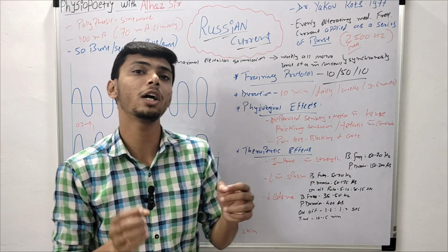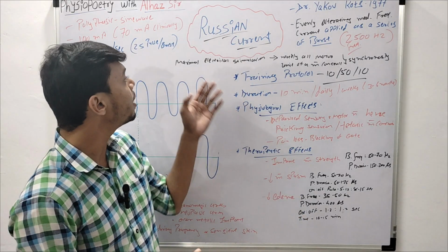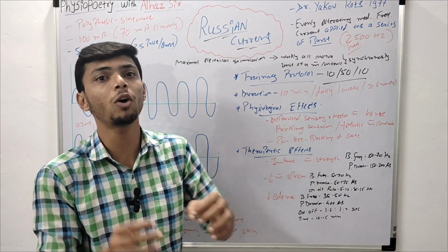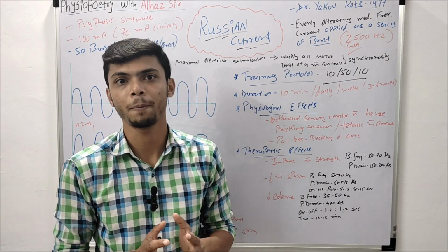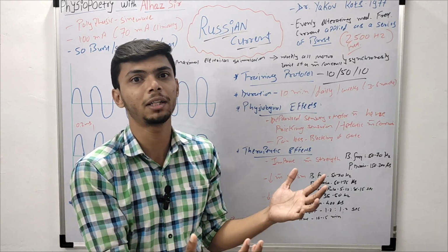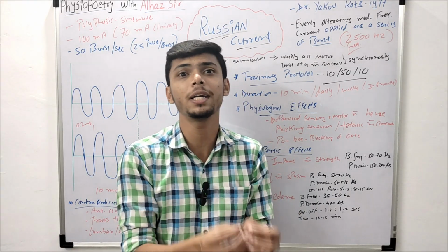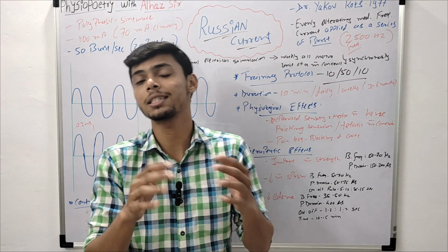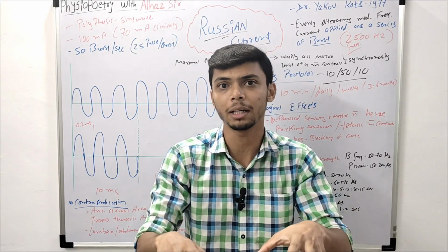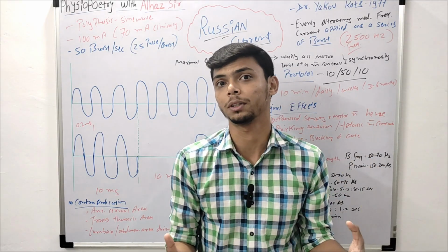तो मोटर यूनिट का जो मैक्सिमल कॉन्ट्रैक्शन है वो करवाएगा. कैसे? It will be this electrical stimulus, it will stimulate, it will activate almost all the motor units. मसल के आसपास जितने भी मोटर यूनिट्स हैं उन सभी को एक साथ एक्टिवेट कर देगा, जिसकी वजह से क्या होगा कि all the motor units will be stimulated synchronously, एक साथ simultaneously वो सिंक्रोनाइज होंगे, and all the motor units will fire at the same time, and it will cause a good amount of contraction of a muscle.